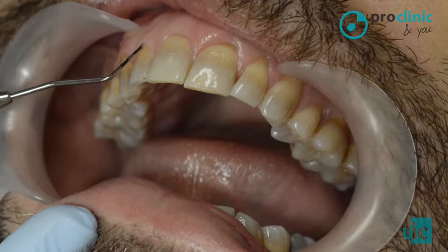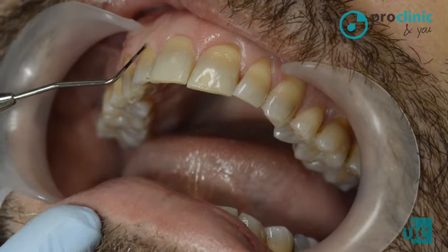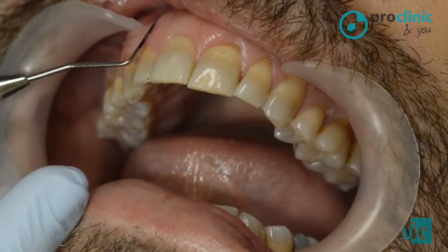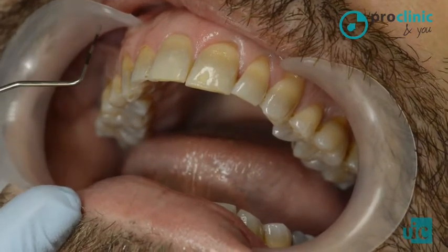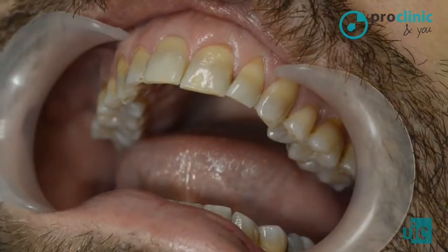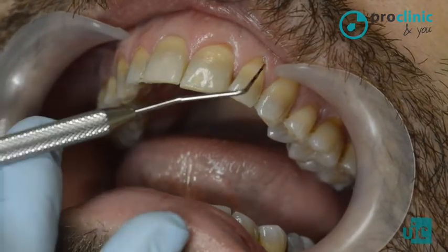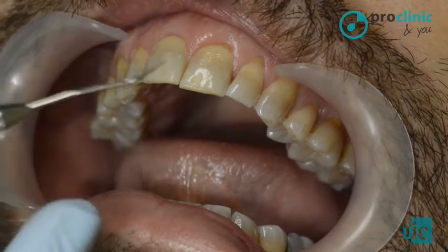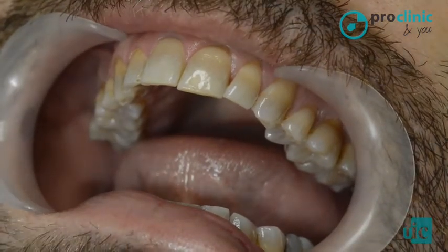So 9 minus 2 is 7 millimeters. So in tooth number 1.2, we have 7 millimeters of attached gingiva. It must be evaluated in all the dental pieces. And as I said, values of 2 or less must be noted.